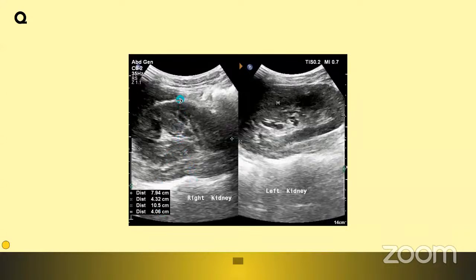Fine. So this right kidney, here we have the renal capsule, you can see the kidney nephrons here, the renal hilum, you can appreciate it. Here some hypoechoic or anechoic regions are seen. Here also you can see, but this is complete. This can look completely normal because we also have a lot of fat around. This is the flank region, right? So we have a lot of fat around. So these are deeper structures. So we have muscles, etc.